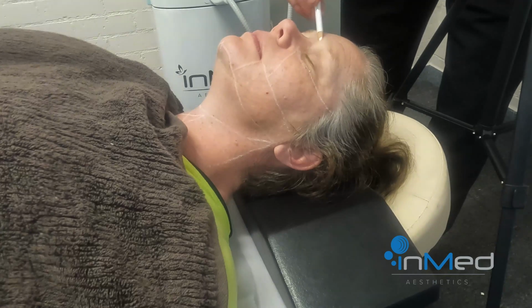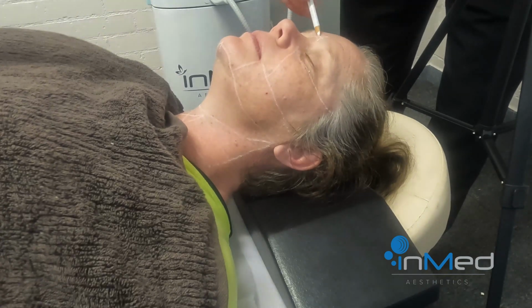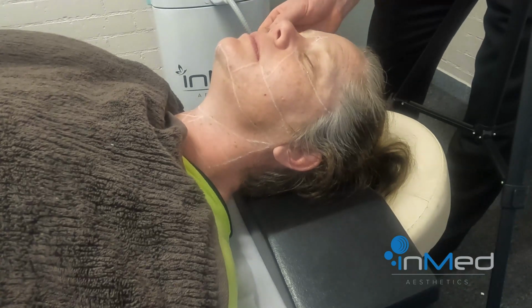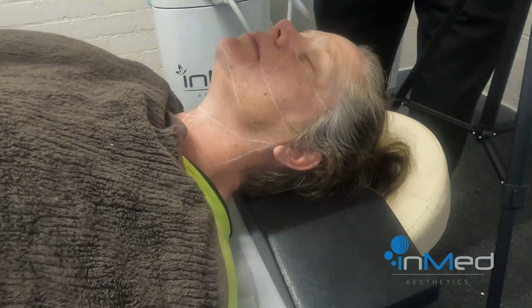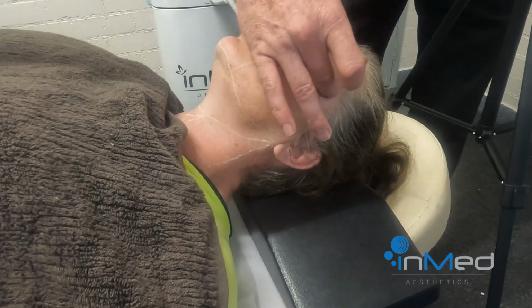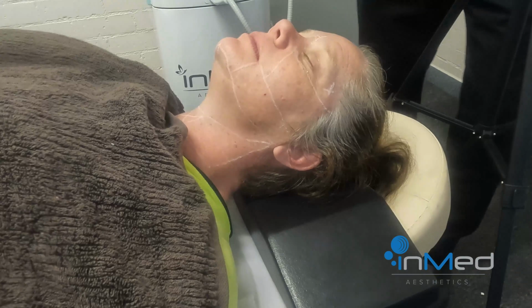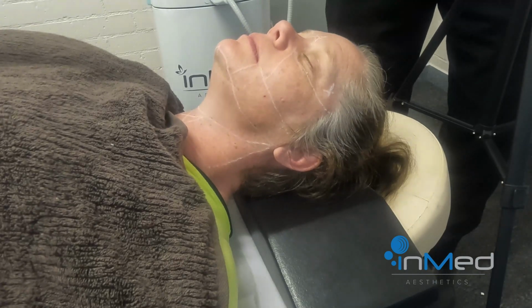We also have a no treatment zone in the middle of the forehead right here, where there's a lot of nerve endings. Also, we feel for the temple and mark it off as well. So feeling for the soft point of the temple, marking it off as a no treatment zone. What we now have is all of our facial regions marked up.